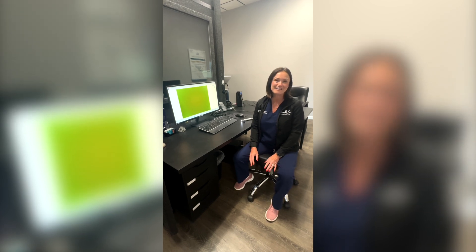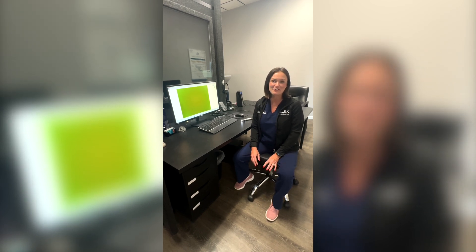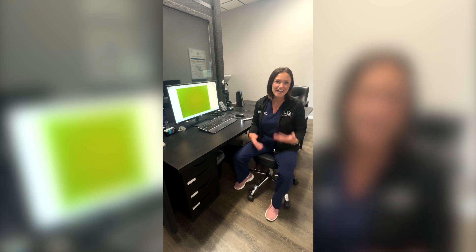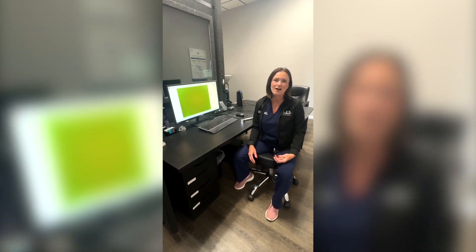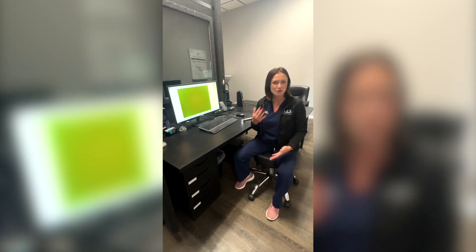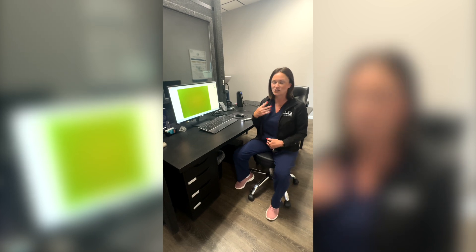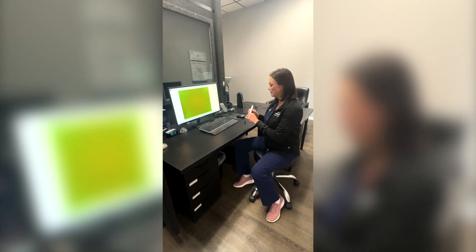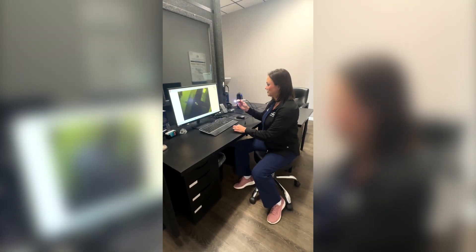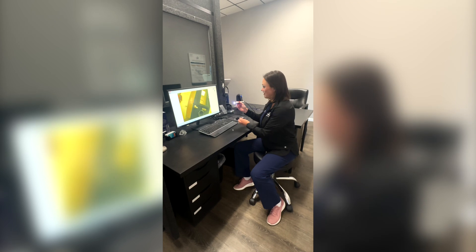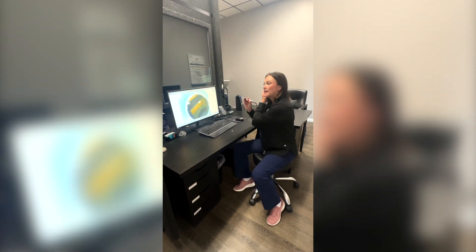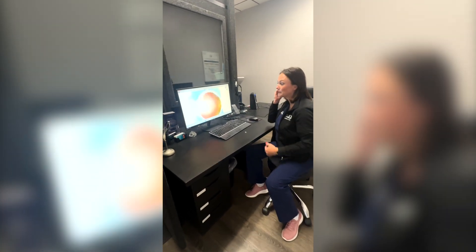I keep seeing a lot of stuff online about video otoscopy and what we can actually diagnose when you come into our office. So I'm going to show you my anatomy on the screen here. Typically we're just going to have this little device, put a specula on it, and then go up to my ear.